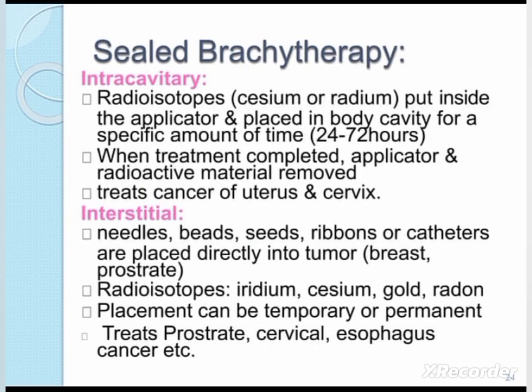In sealed brachytherapy, intracavity radiation therapy is there. Intracavity radiation therapy means here we are using radioisotopes such as cesium 137 and radium that will be put inside the applicator and placed in a body cavity for a specific amount of time, for example 24 to 72 hours.